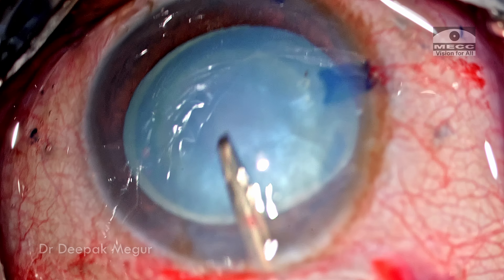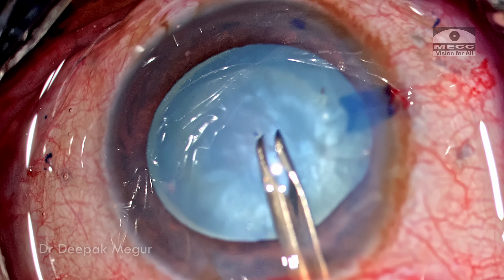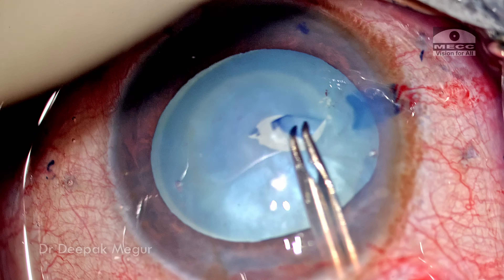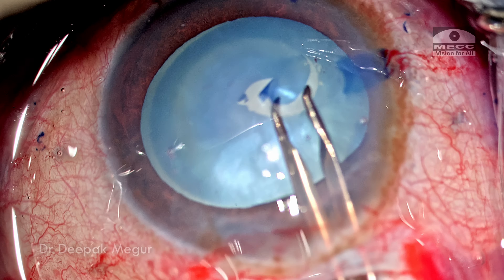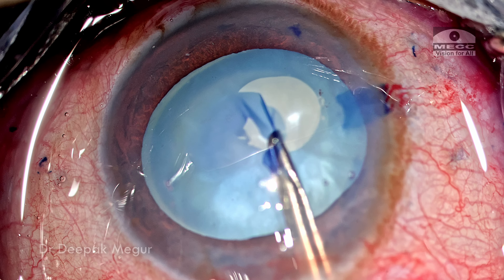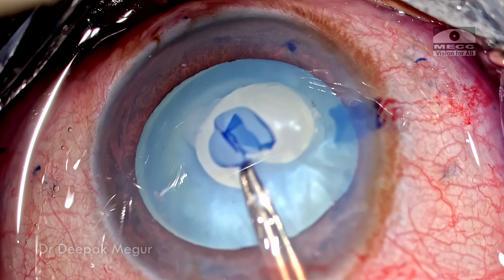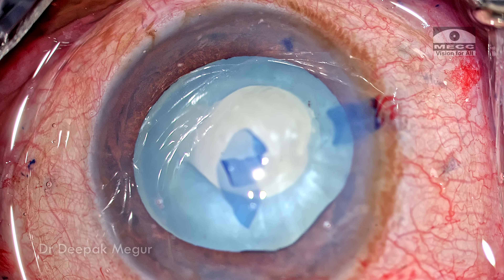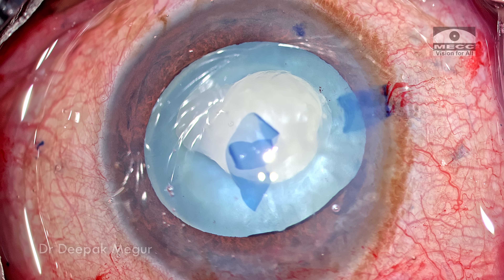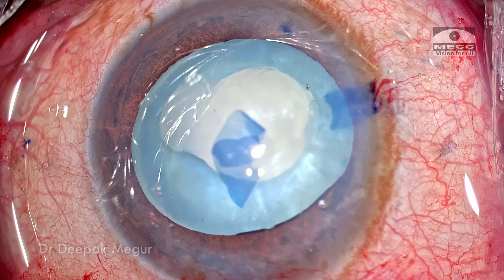I puncture the anterior capsule with the forceps and then the flap is raised. As I'm tearing, I'm trying to keep the flap flat, not everted — pulling it centrally repeatedly is the tearing method. In these highly tense capsules, the moment we fold and try to use the shearing method, there is a higher risk of it running away. Keeping the flap flat and pulling it centrally repeatedly is the way to go; control is not perfect but the risk of runout is significantly lesser.